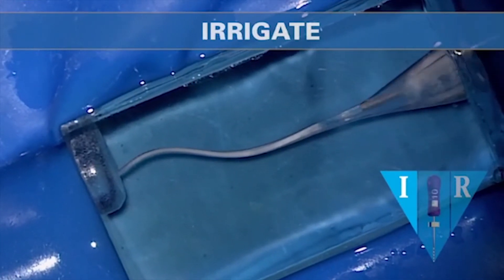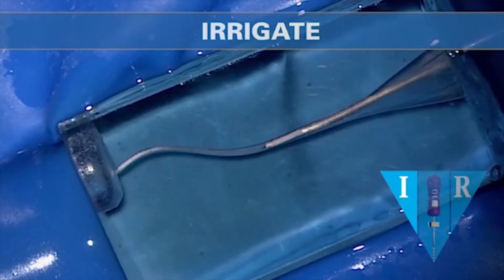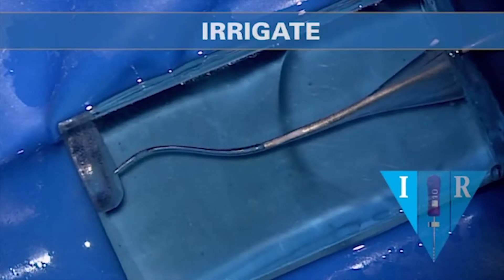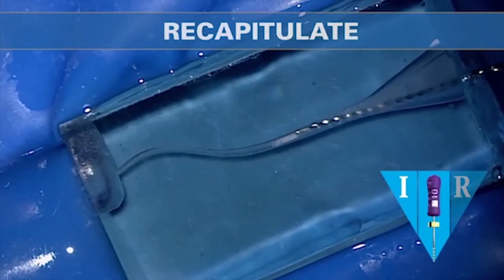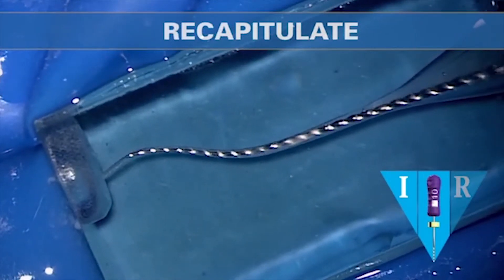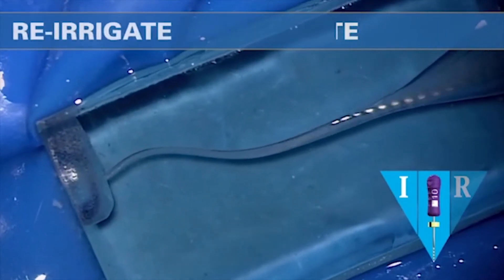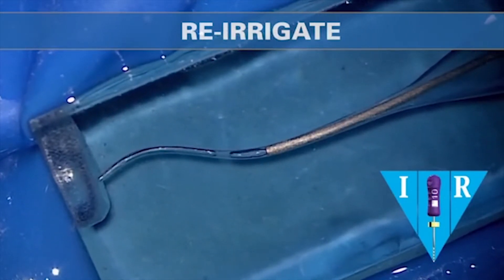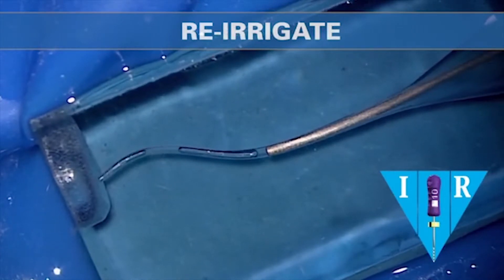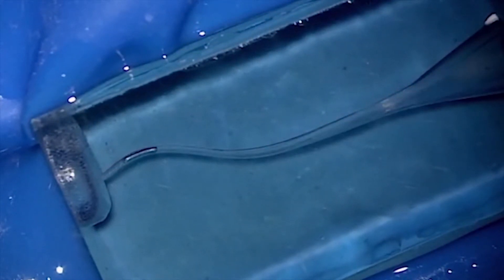When you pull any mechanical file out of a canal, it's important to irrigate. Irrigate kicks out gross debris. Then we can recapitulate with a 10 file or, guess what, you can recapitulate with the ProGlider. Either one of those instruments is able to break up debris and move debris into solution so that it's loose debris, and that loose debris can then be liberated from the canal when we re-irrigate. Notice the cannula doesn't need to go deep — it only needs to go about to the middle one-third of the entire working length. I can irrigate, vacuum, irrigate, vacuum, irrigate, vacuum. I'm using a 25-cent syringe with a 29-gauge cannula.